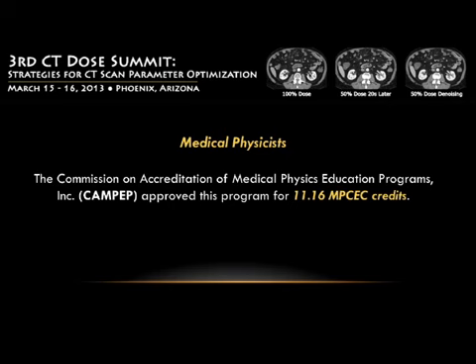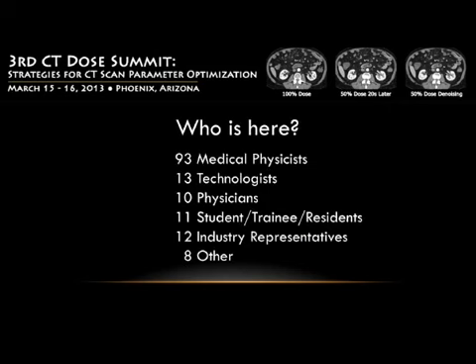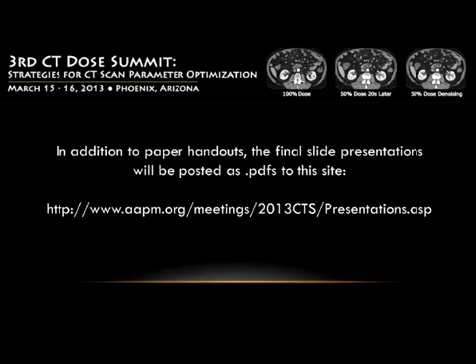You may see that kind of activity at your own place, that for the larger patients, you may need to do things a little differently than for the medium and small patients. For our routine settings now, we've got two groups: the small and average, and the large patients. We use different noise index values and different min and max values for those two size groups for all of our adults. That's how we've decided to deal with it.